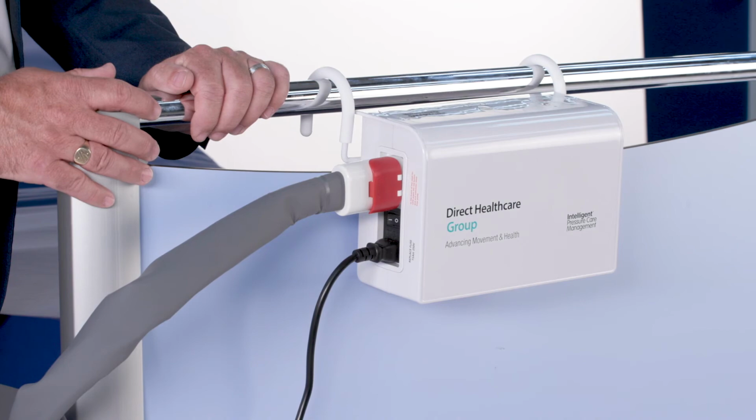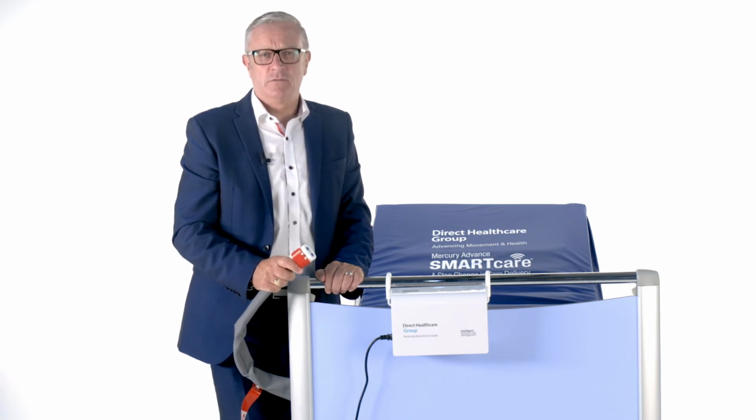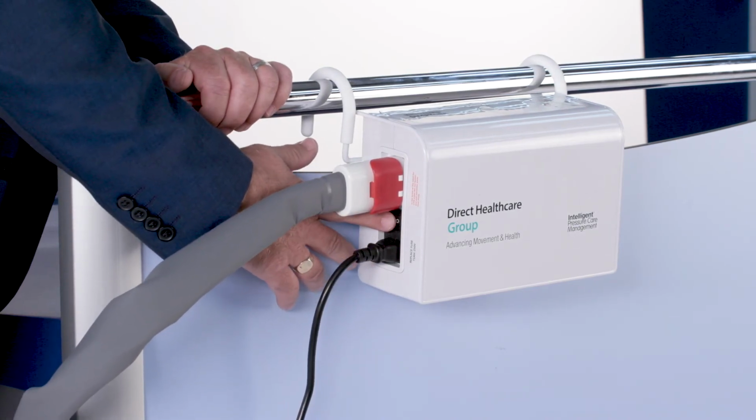If the connector is still connected to the pump while the power is turned off, this will eventually, over a period of time, deflate the heel cells. Therefore, it is important to disconnect the quick release connector when the pump is turned off. To turn the pump on, simply press the on-off switch located on the side.